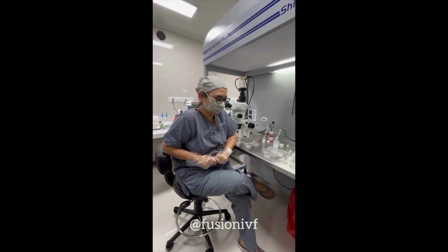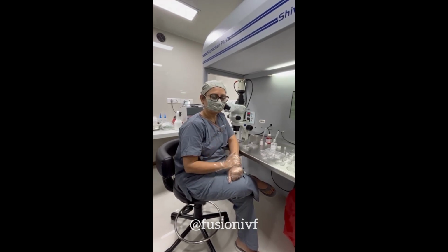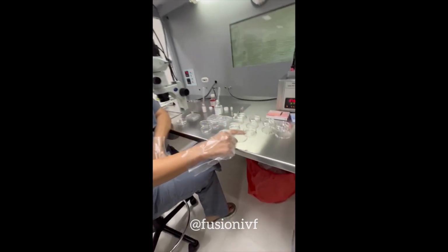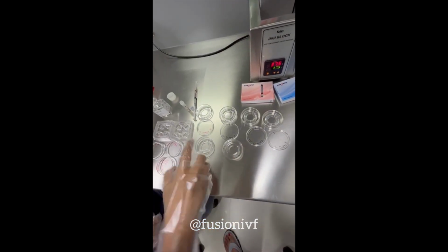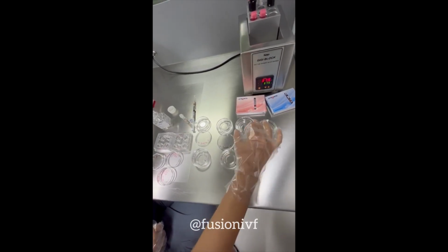Naik, embryologist from Surat. Today we are preparing for 5 FETs, which we are having tomorrow morning, and we will be doing biopsy for 5 embryos. So these are the plates which we have prepared for 6 patients' FET. One is for the biopsy patient and the other 5 are the regular FETs.